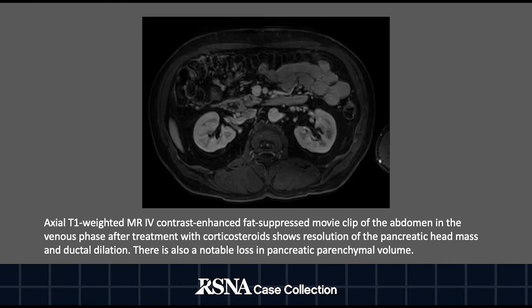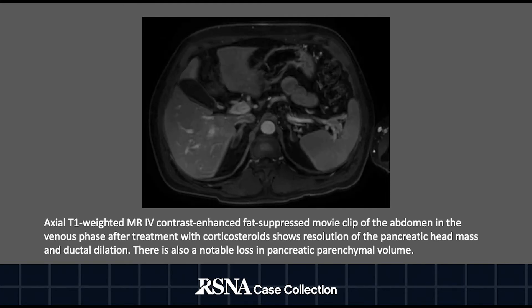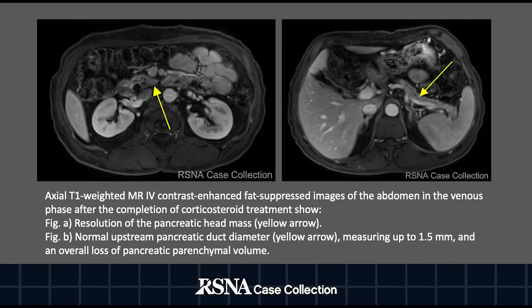Axial T1-weighted, MR IV contrast-enhanced, fat-suppressed movie clip of the abdomen in the venous phase after treatment with corticosteroids shows resolution of the pancreatic head mass, pointed out by the yellow arrow. And in figure B, normal upstream pancreatic duct diameter measuring up to 1.5 mm and an overall loss of pancreatic parenchymal volume.